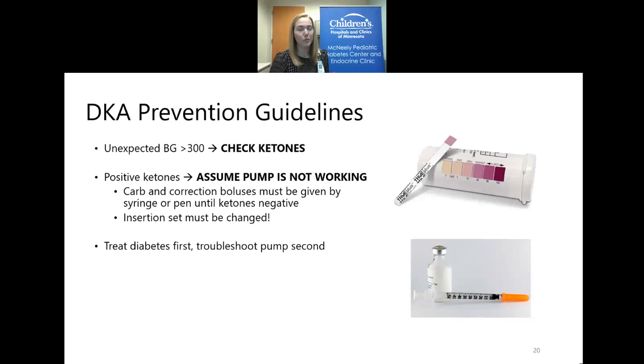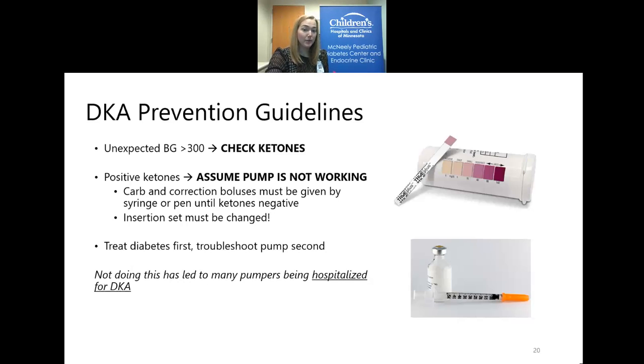Then we're going to look at the pump. What's wrong with it? Why is it not working? Again, not doing this has led to many pumpers being hospitalized for DKA, so please follow the guidelines. It will help you in the long run. We don't want to be that guy.